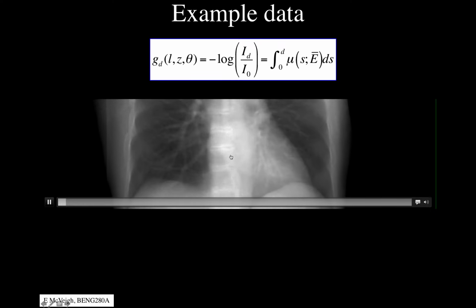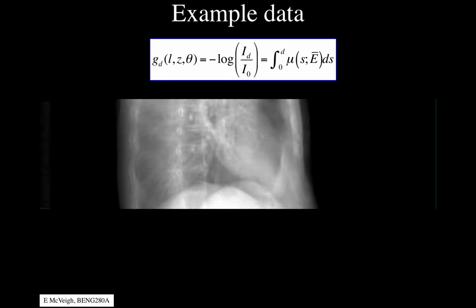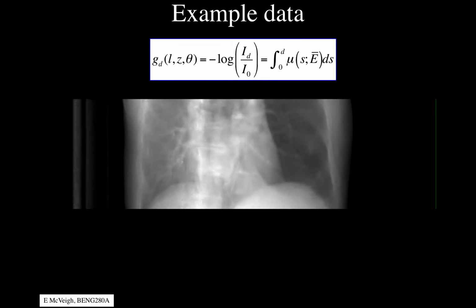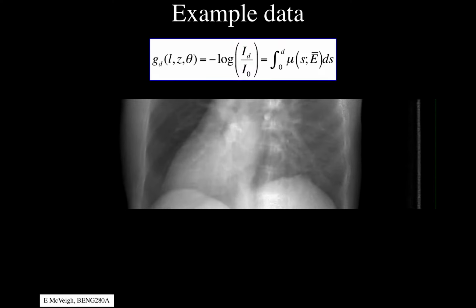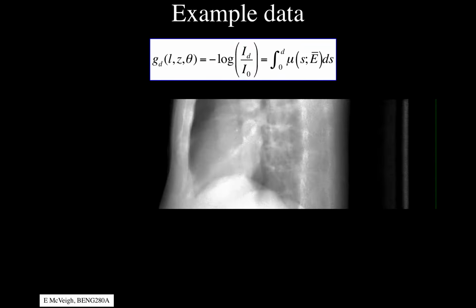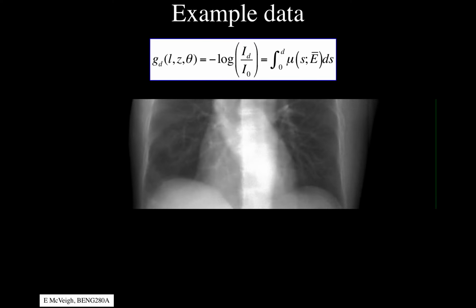I should have made G of that thing, but I didn't have it. In fact, to get G from an actual imaging system, you usually have to lean on the manufacturer to help you get it, because they know all of these correction factors and how to normalize to the incident beam.